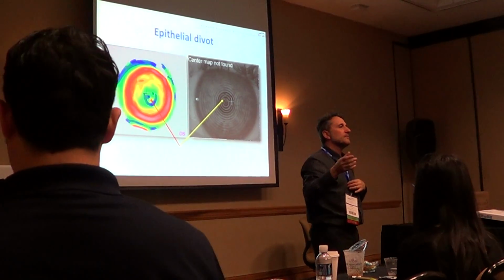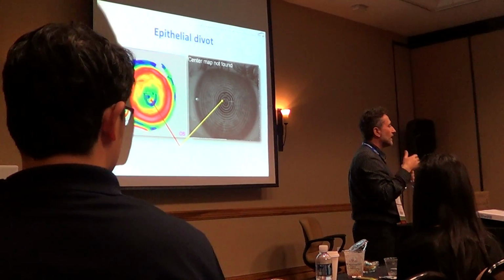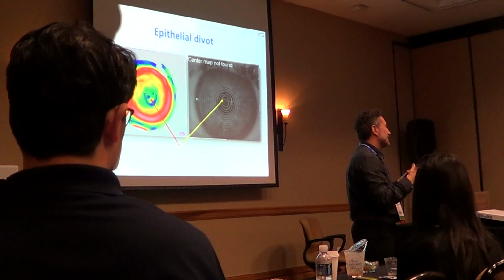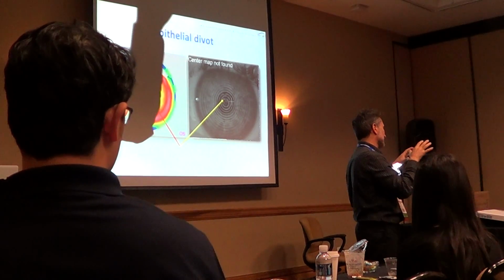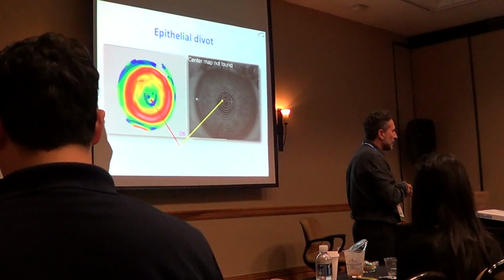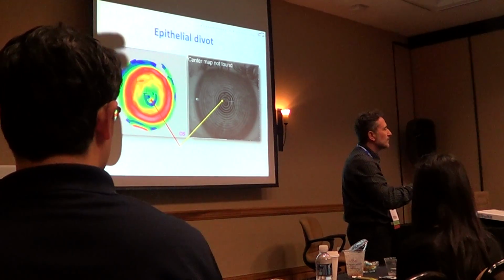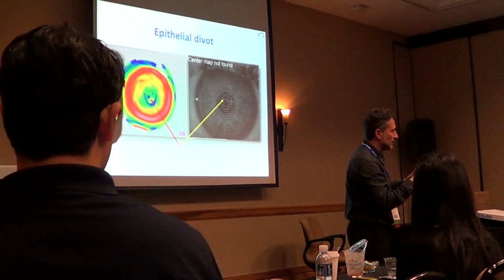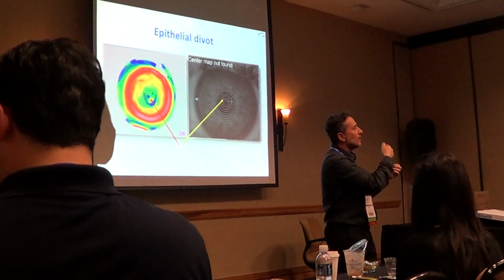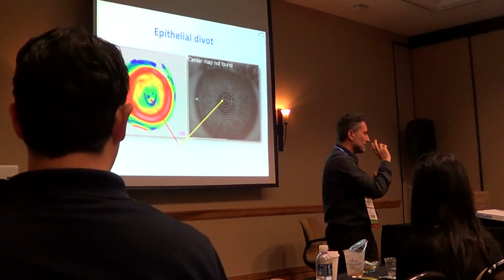Even if I don't release the patient for 20 minutes in the waiting area, I strongly recommend that at the beginning you do that. And after that, do the first overnight trial. But when you have some experience with the fluorescein pattern after 3-4 minutes of wearing, you are ready to say, okay, you could wear these lenses overnight or not. You don't need more steps, but at the beginning, it's strongly recommended. Leave for 20 minutes, look at the fluorescein again after 20 minutes, look at the topography differential map to see the centering, the issues and so on, look for health and so on, every step at the beginning. But after that, you could move on and make things quicker.